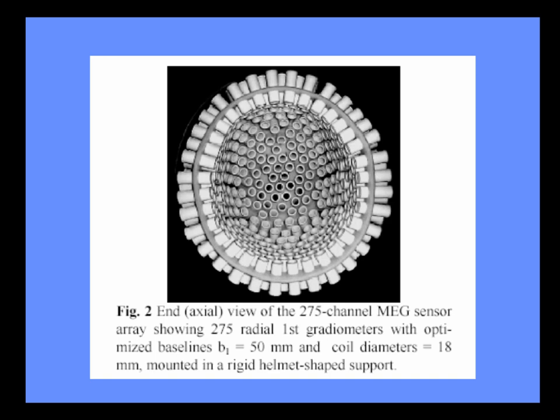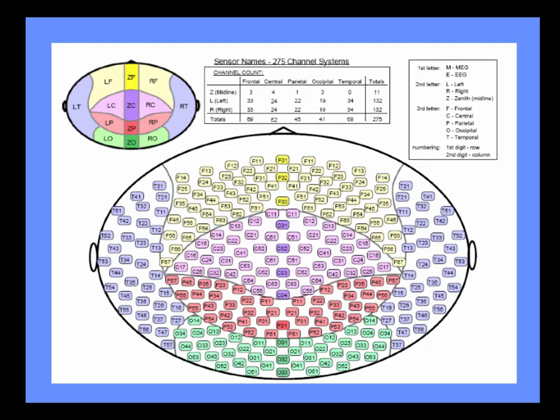We pick up signals from the whole brain, but the maximum spot, if you were to look at just sort of a gain curve, would be at the cortical surface. So this is just a two-dimensional sort of topogram of the 275 channels laid out, just so that we kind of know where they are.